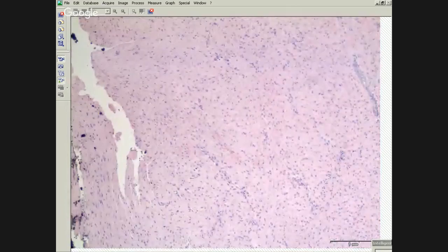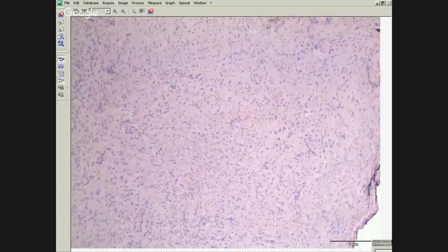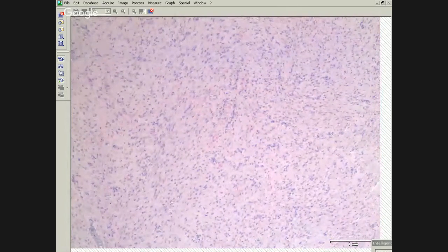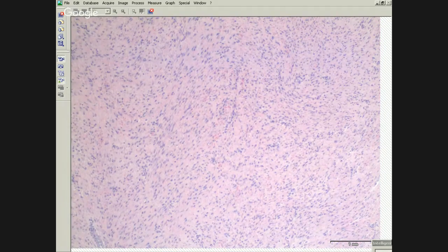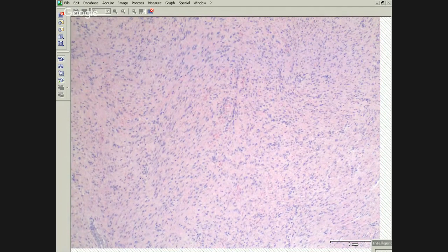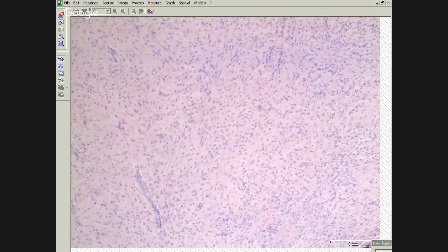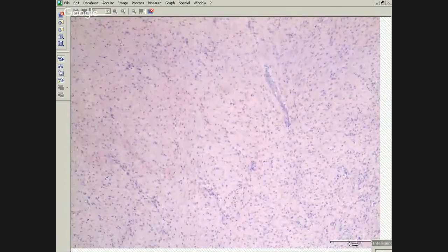So this can again rarely occur in this location. When this was initially resected, we were told it was called solitary fibrous tumor. You can kind of see why somebody would be thinking that. I don't know if they stained it or not, but you can imagine that, common things being common, they get a spindle cell mass in the pleura and are going to call it solitary fibrous tumor. But you can see the vessels are different.